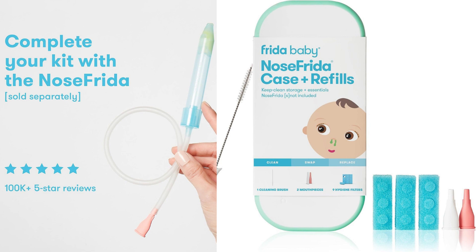One of the standout features of the Nose Frida Case Plus Refills is the inclusion of hygiene filters. These filters are an essential part of the Nose Frida system, as they prevent mucus from entering the tubing and ensure a clean and hygienic suction process. The case provides a convenient storage space for these filters, keeping them organized and readily accessible. The bristle cleaning brush included in the package is also helpful for keeping the Nose Frida clean and free from any residue.